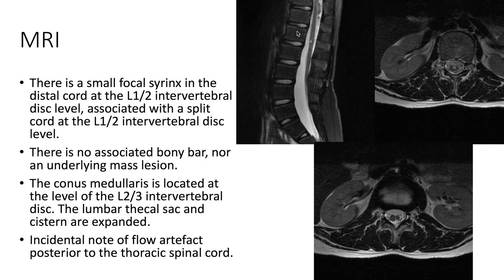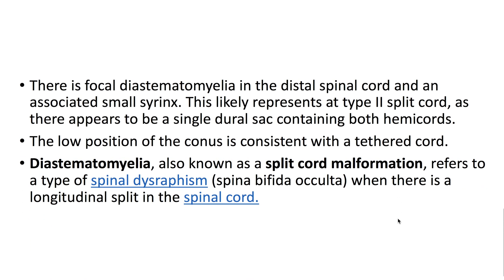On MRI, we see a small focal syrinx in the distal cord at the L1-L2 intervertebral disc level, associated with a split cord at this same level. There is a focal diastematomyelia in the distal spinal cord and an associated small syrinx.